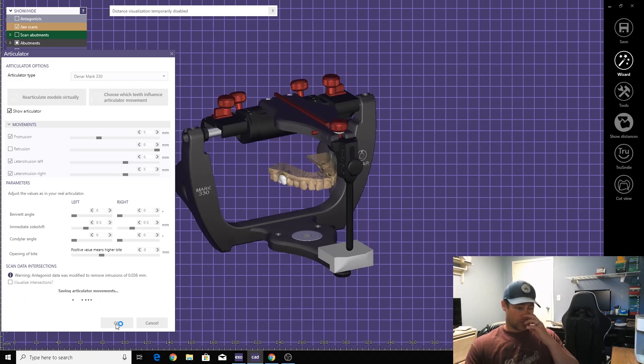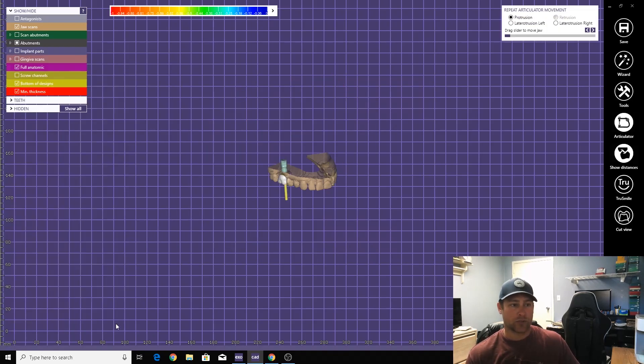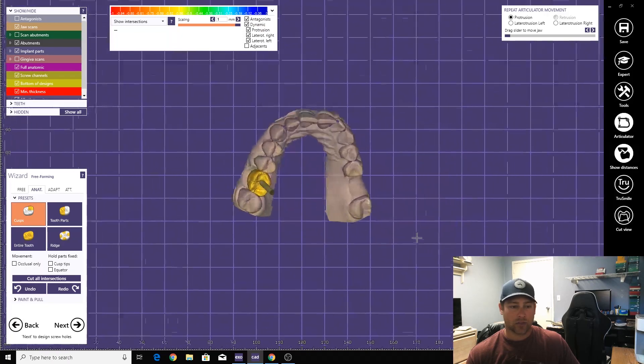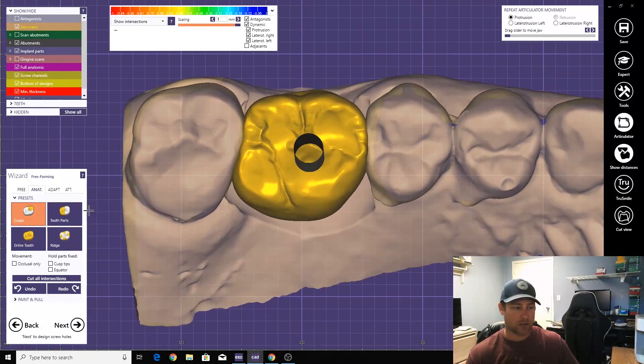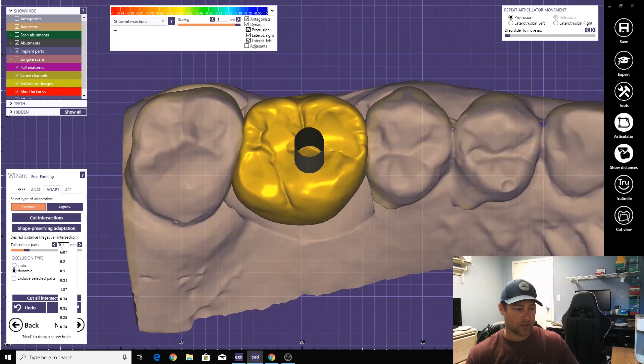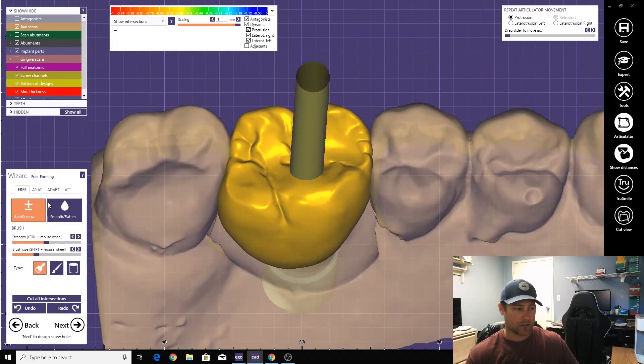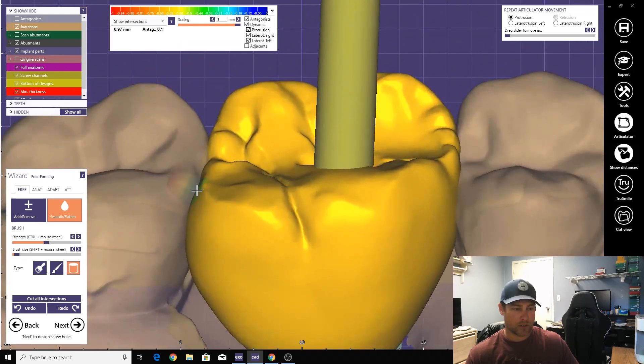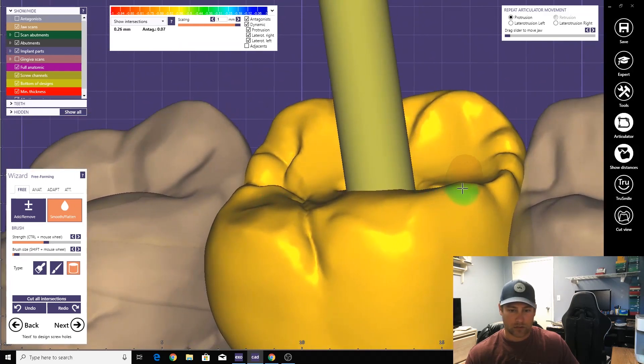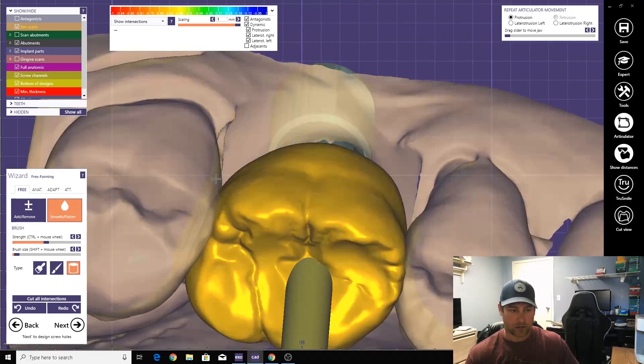This is where the new cutter tool using Medit really is handy, especially on these screw-retained cases. I'll show you here in a second. Let's drop this down. All right, let's do sharp angles. Cut these out. Okay, cut down. Okay.